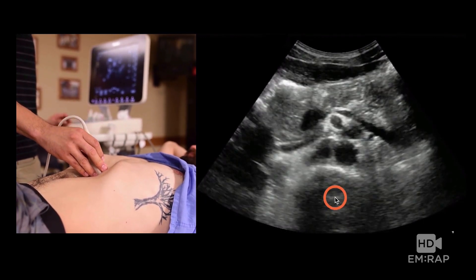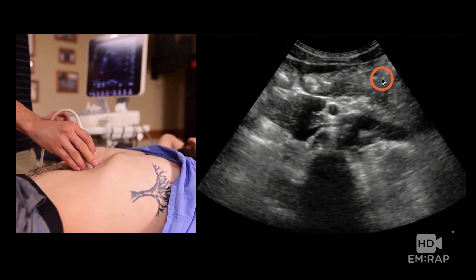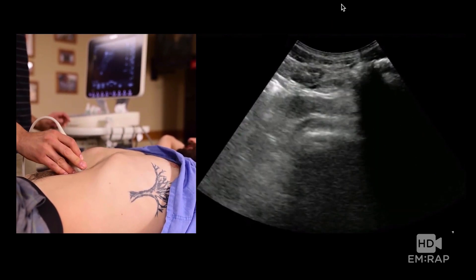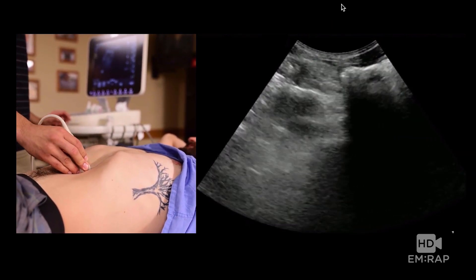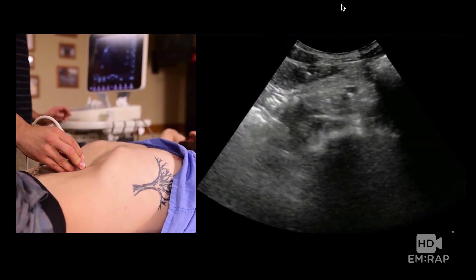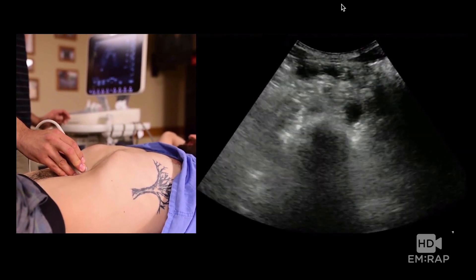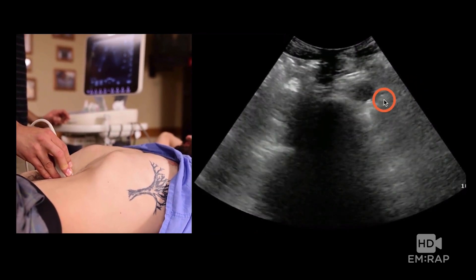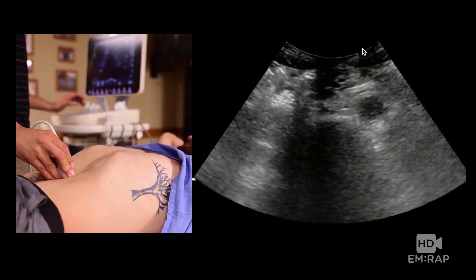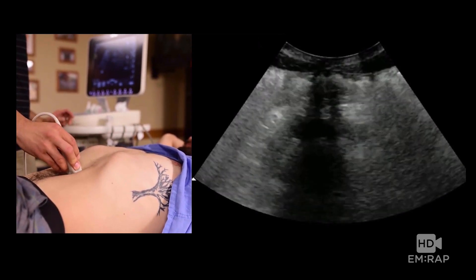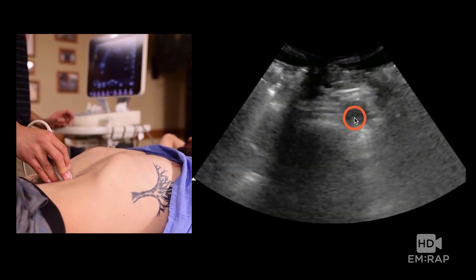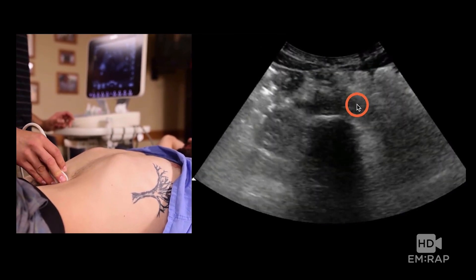Over here you have the aorta, a vertebral body down here, and the IVC. You'll often run into the issue of bowel gas getting in the way. A couple of tricks: one is to just push harder, and you can try approaching it from different angles. Push a little bit harder and the bowel will peristalse out of the way. You want to get the aorta as proximally as you can in the epigastrum and follow it all the way down until you get to the split of the iliacs.